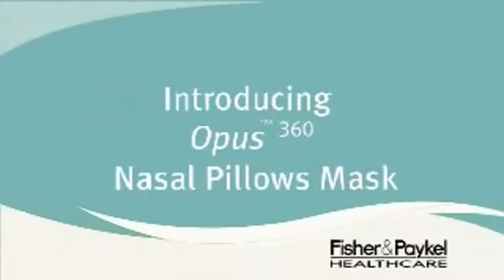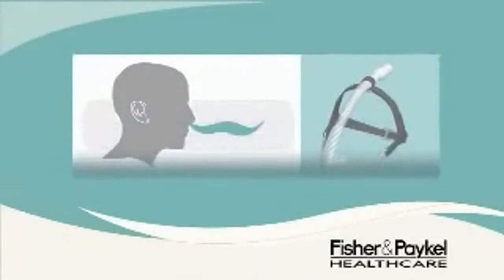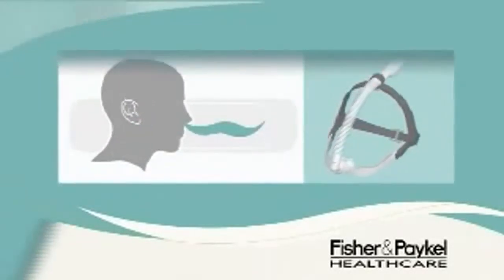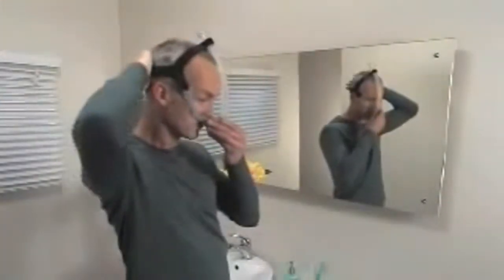You have just received the Opus 360 Nasal Pillows Mask for the delivery of pressure therapy directly to each nostril. With this type of mask, you must only breathe in and out through your nose.